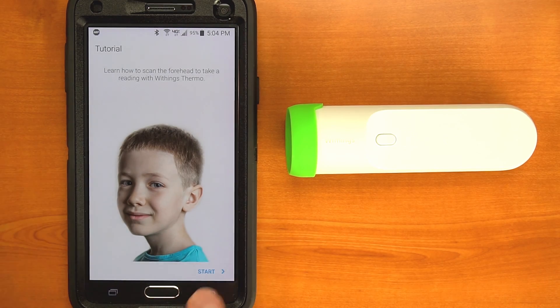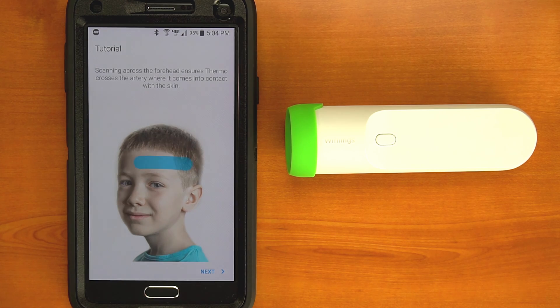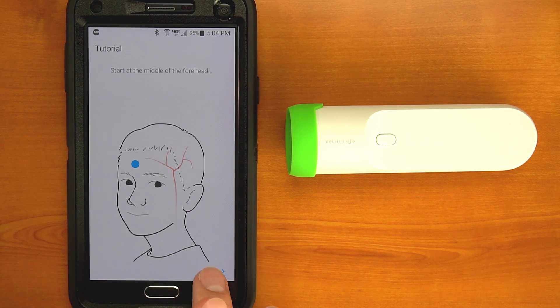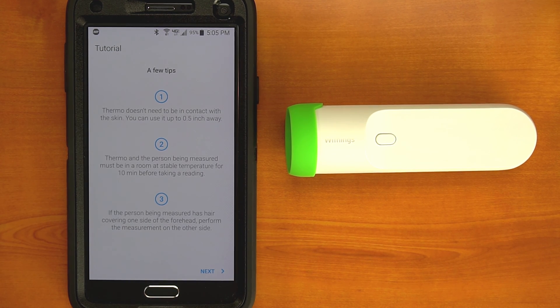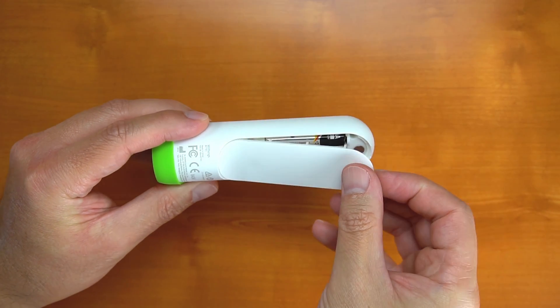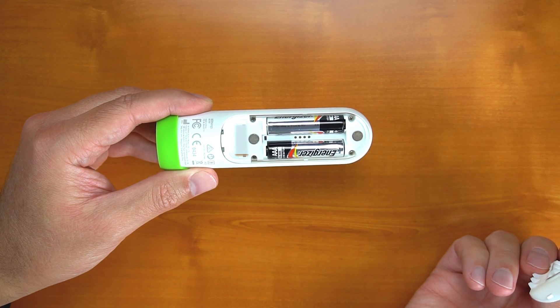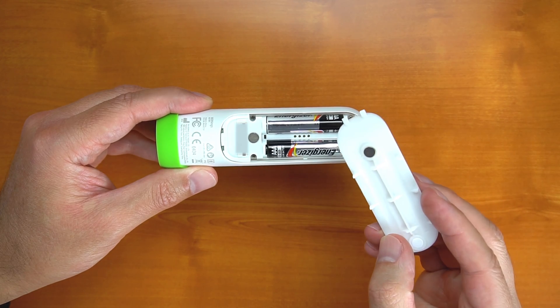I found the setup process to be pretty quick and painless. You'll need to install the Thermo app onto your phone or tablet to do this. As soon as it's installed, it'll take you through a tutorial so you can see exactly how you're supposed to take measurements. The Thermo takes two AAA batteries, which are accessed by removing the magnetically attached cover on the back. Battery life is rated at two to three years, which means you won't have to change them often.